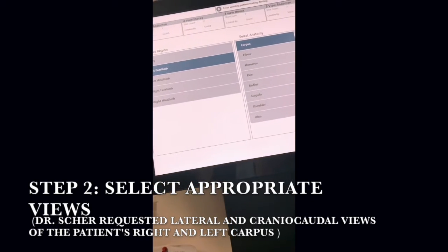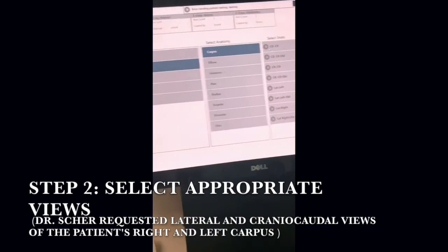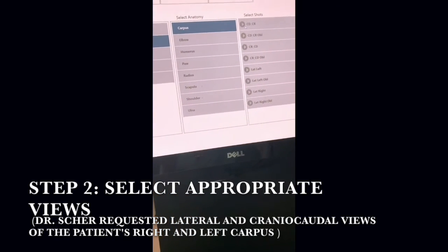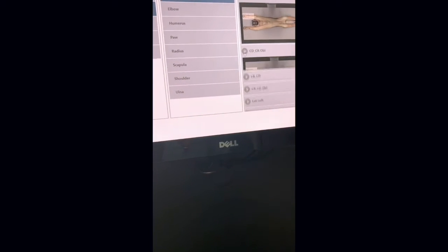swelling. Medical conditions that could potentially lead to radiographs of the extremities include fractures, pain, lameness, developmental dysplasia of the bones and joints, and trauma. Even though pain and inflammation was coming from Charlie's right carpus, radiographs of Charlie's left forelimb were also obtained for comparison. When radiographing her extremities, X-rays of the opposite limb are always a valuable reference.